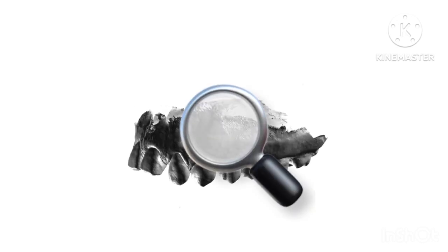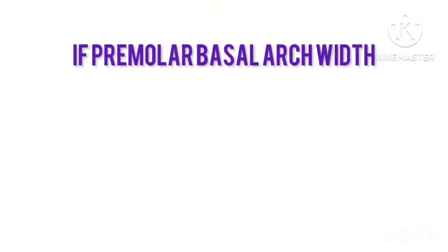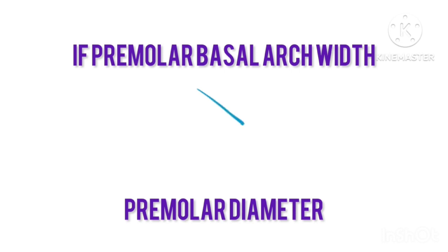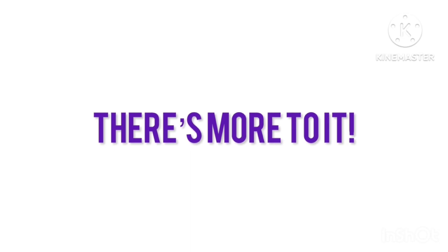If the canine fossa is not visible, the measurement is made from a point 8 mm below the crest of the interdental papilla distal to the canine. Coming to the inference, if the premolar basal arch width is greater than the premolar diameter, then arch expansion is possible. Ashley-Howe analysis does not stop here.